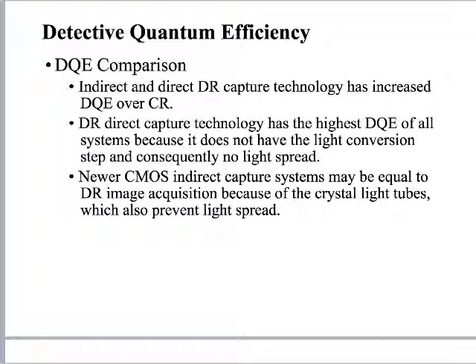So if you're wondering why in the course of your clinical career you've seen more people adopt DR, it's because at the end of the day it's going to affect their pocketbook, right? If they don't improve on it. So all of these managers were really happy when they came out with wireless DR receptors, right? Why? Because you can use it like a CR system. I don't have to buy a new room. I just buy a wireless DR receptor, stick it in an old room, right? So you've seen this. This is where this is bringing us up to speed right now.